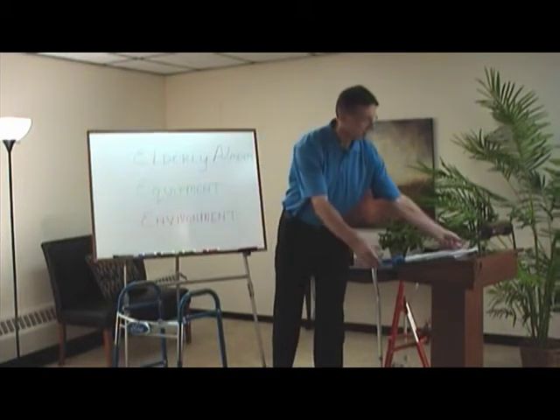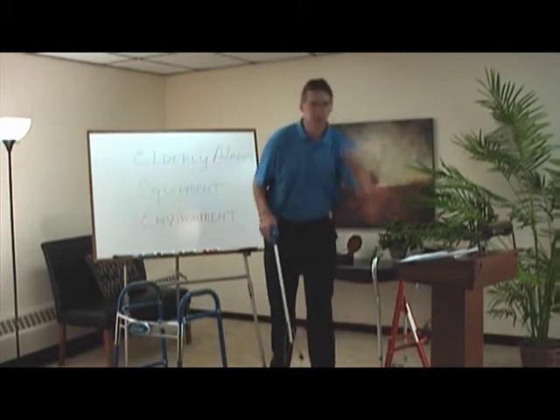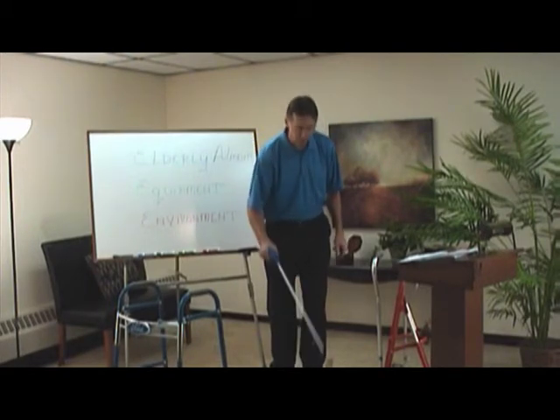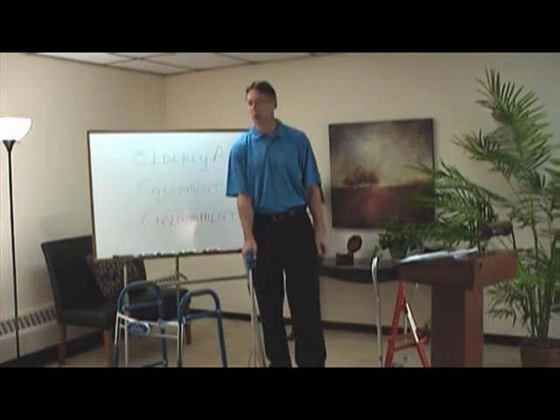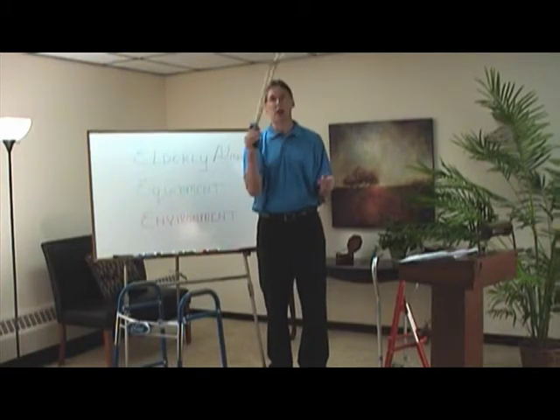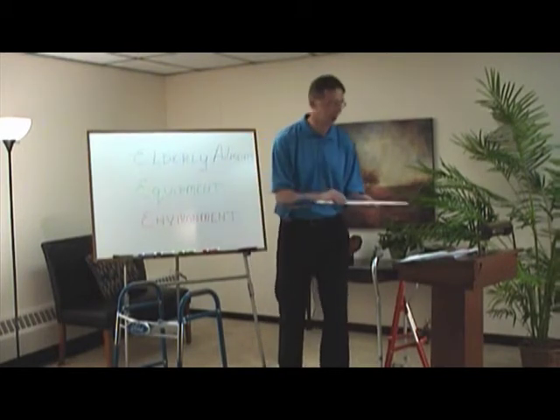Reachers. These are a good thing to keep around the house in a lot of different areas. You're not going to be able to see this, but I'll drop a pen. They can pick up the smallest object without any difficulty. This saves you from trying to pick stuff off the floor, which is often a time when people fall, and you can also pick things up from higher shelves. If you have trouble with falls, there's no reason you shouldn't have a lot of these in the household.